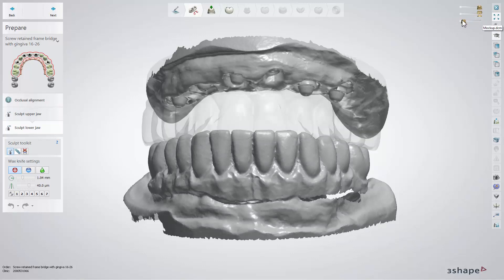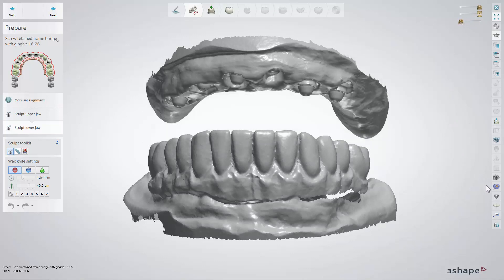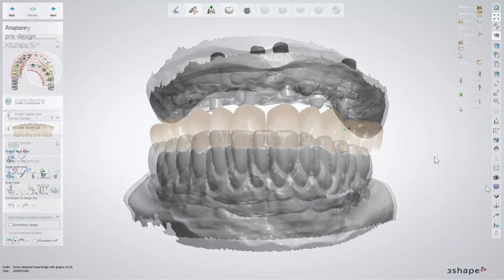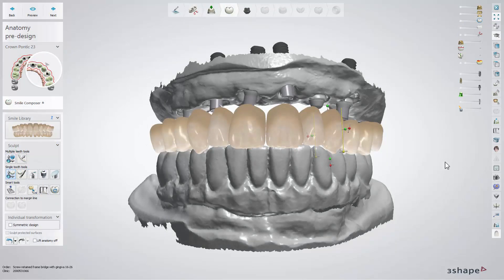You can also find here the same additional scans button that contains the additional scans functionalities. That functionality is available on all designing steps.